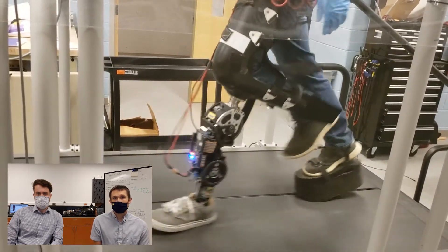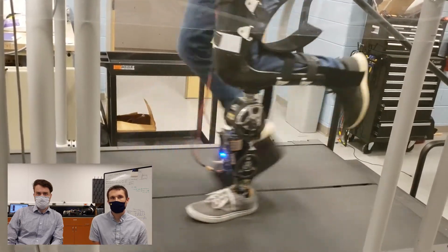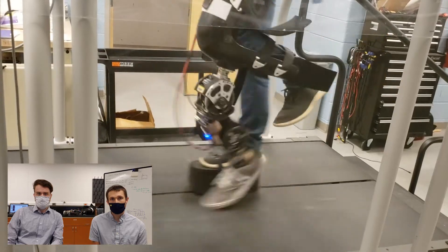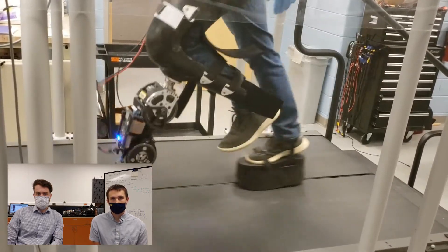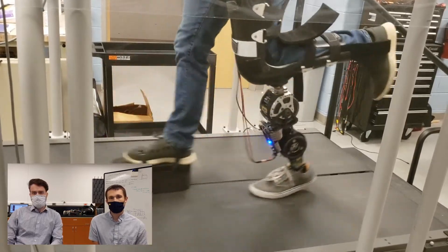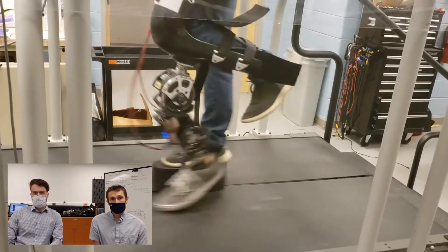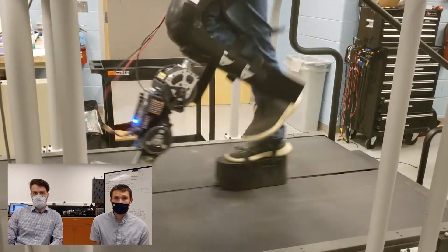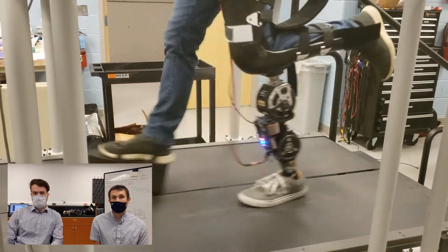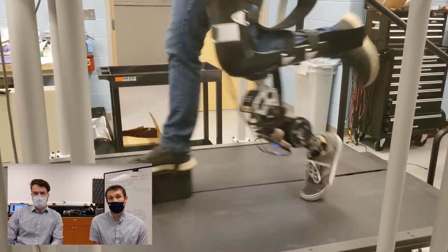Lastly, we would like to point out the low acoustic noise of the prosthesis. Mainly what you hear during this demo is the bypass adapter creaking, impact at heel strike, and sounds of the treadmill system. If you listen very closely during swing, you can faintly hear the transmission noise. This is an important feature for prospective users who may have a preference for a quiet prosthesis, as this setup would allow them to participate in community ambulation without drawing potentially unwanted attention.